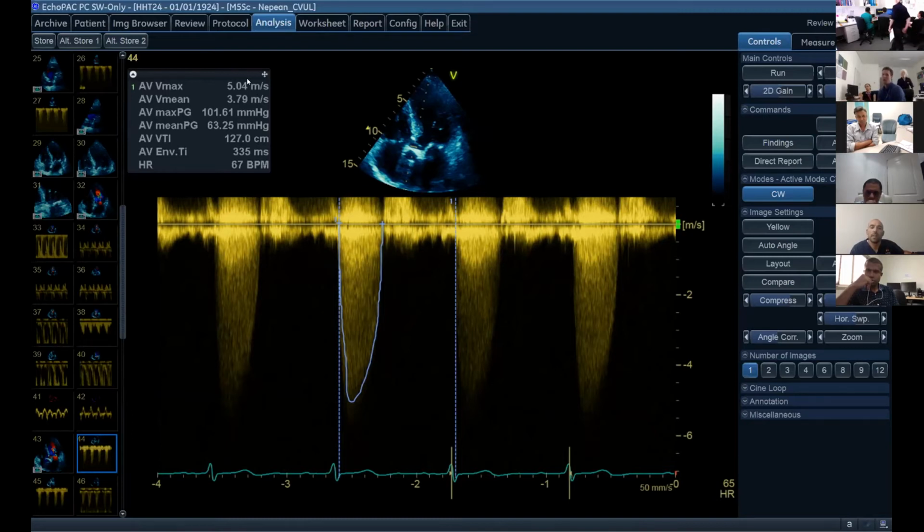So they're calculated on the basis of the velocity. So the LVOT velocity, the modified Bernoulli equation. Beautiful. Cross-sectional area, velocity 1, velocity 2. Beautiful. And what's velocity 2? Velocity 2 is the velocity just distal to the aortic valve. Yeah, or approximately. I guess V1 versus V2. Yeah, because this is before it. So you're right, sorry, V1.